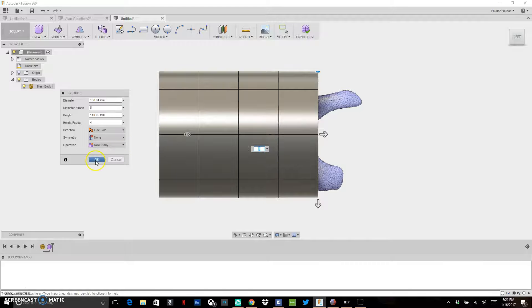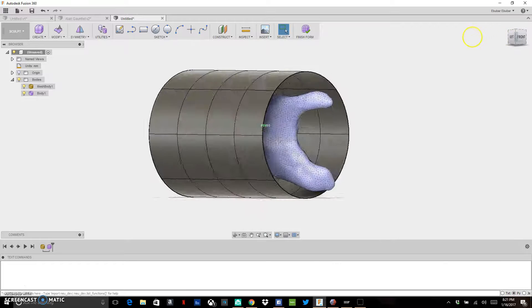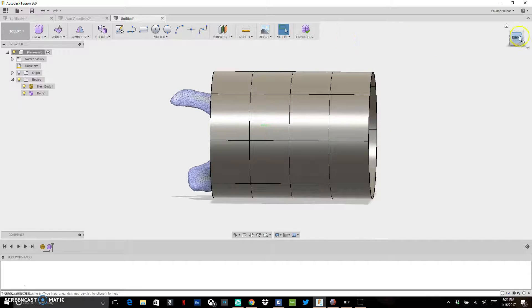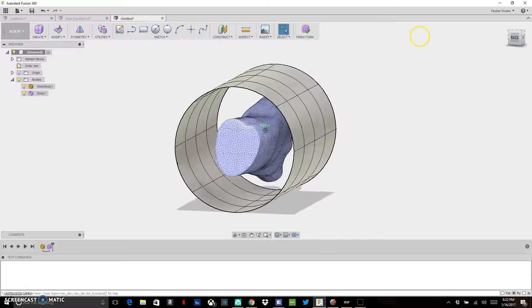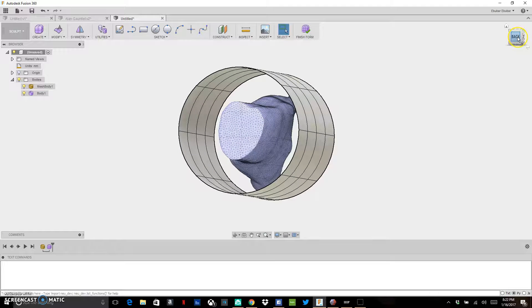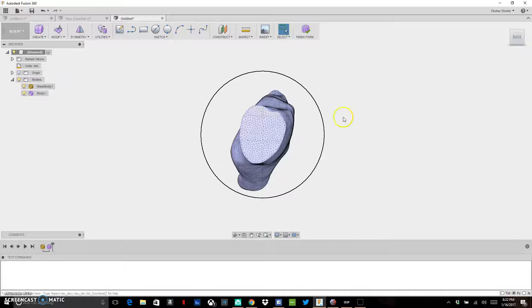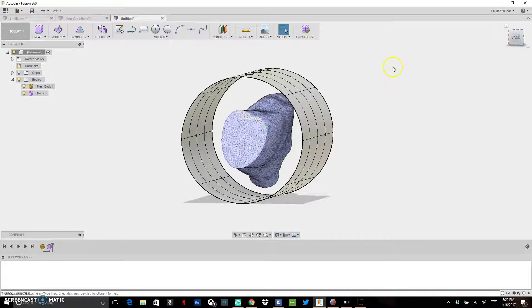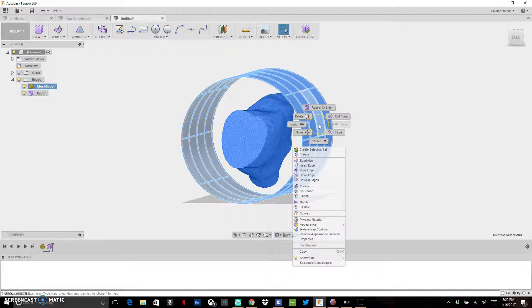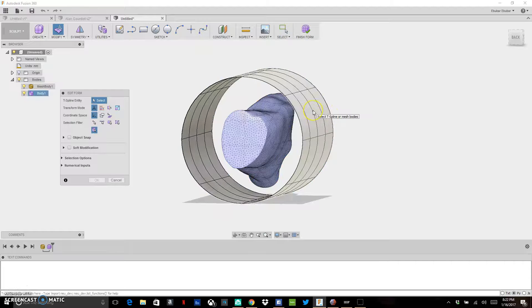Click OK and now we have our cylinder. I need to start sizing it down to fit the 3D scan. First, I want a more elliptical shape rather than a pure cylinder. Looking from the side, I'll click once and highlight everything, then right-click and go to Edit Form, which lets me edit this cylinder.